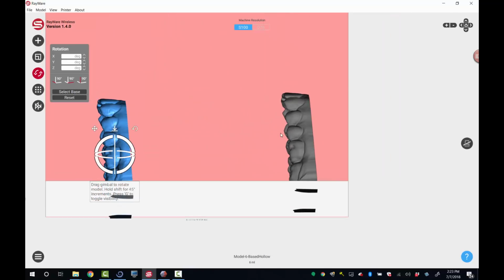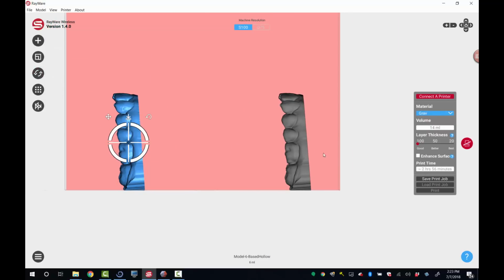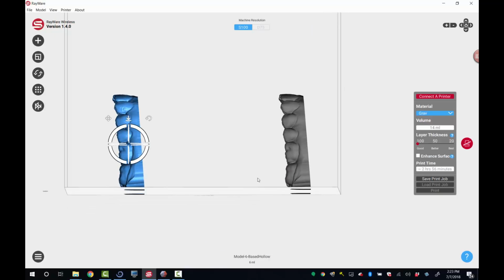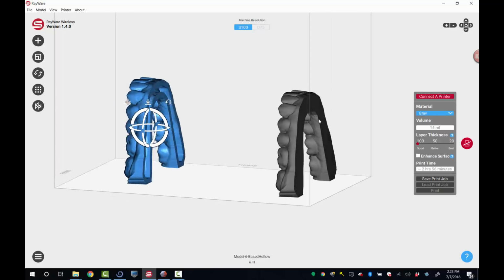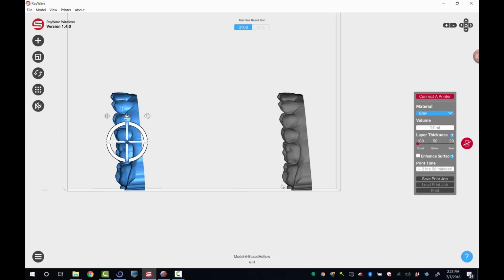Also, one thing I didn't mention is, since you don't have a platform here, the height is different. Instead of 3 hours and 8 minutes, we're now at 2 hours and 56 minutes. That's simply because this isn't raised up on top of a platform. It's not quite as tall. So this distal plane cut is also an efficient way in that regard.